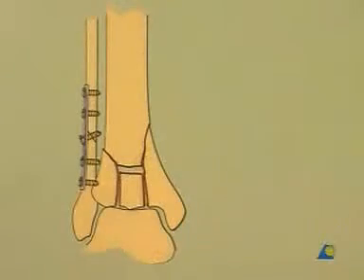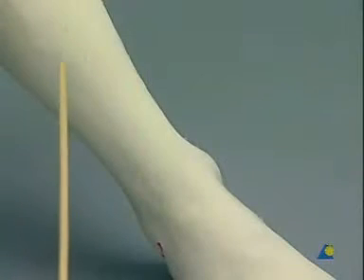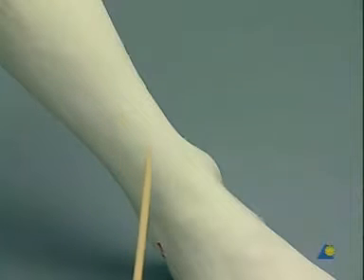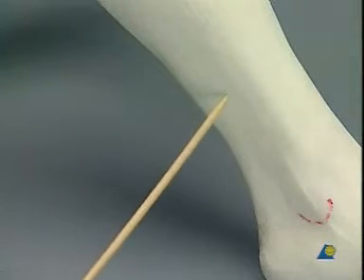Let us start with the first step, the reconstruction of the fibula. To do so, we need to carefully plan the incision for the tibial approach first, as a bridge of intact skin of about six centimeters has to be preserved between the two incisions. This brings our straight incision for the fibula to its posterior edge.